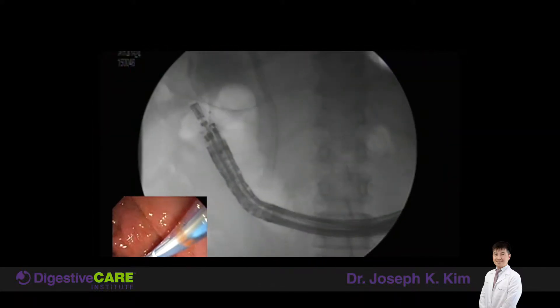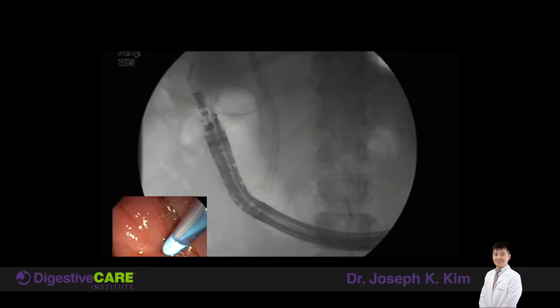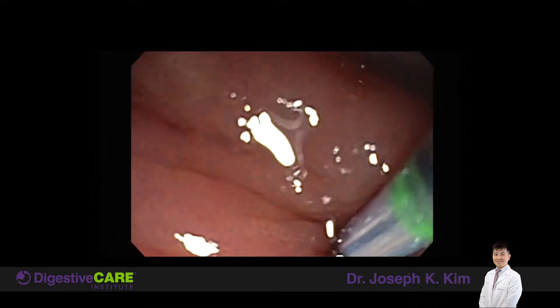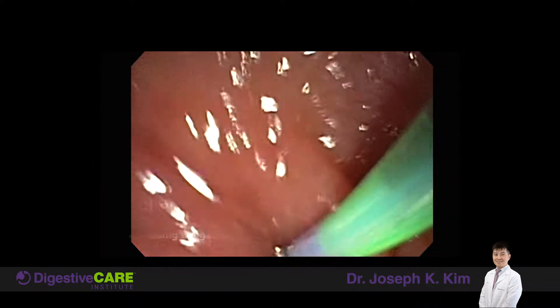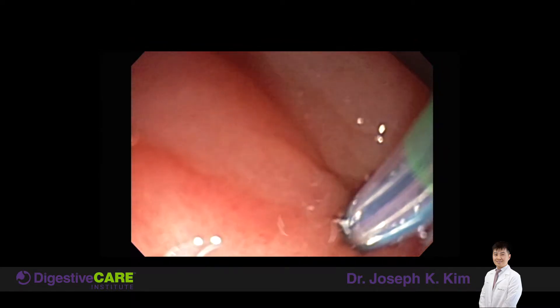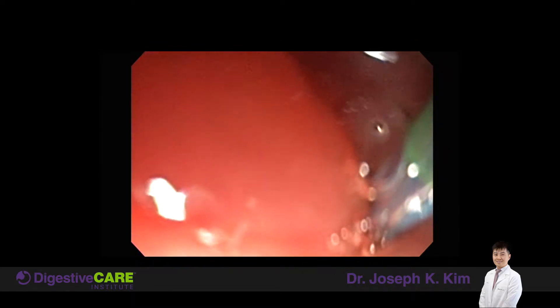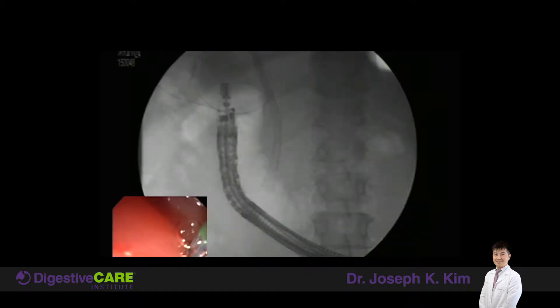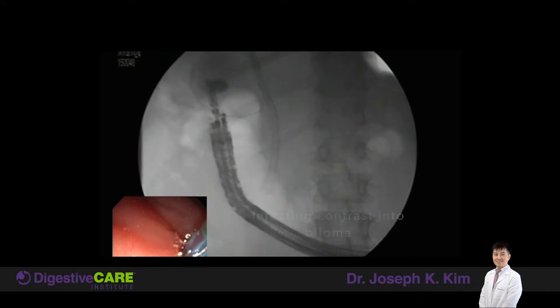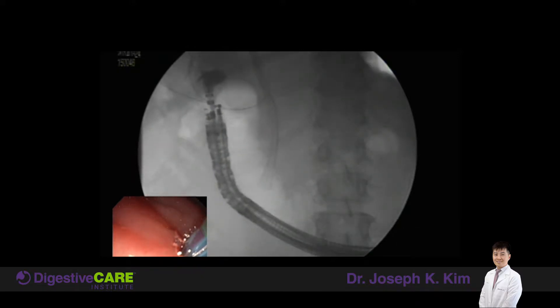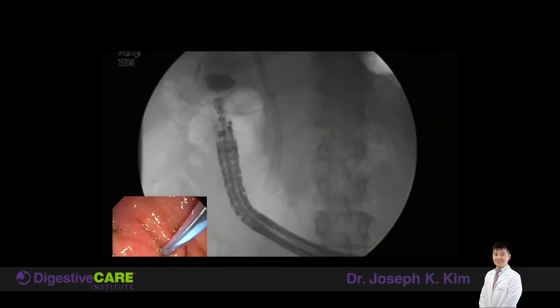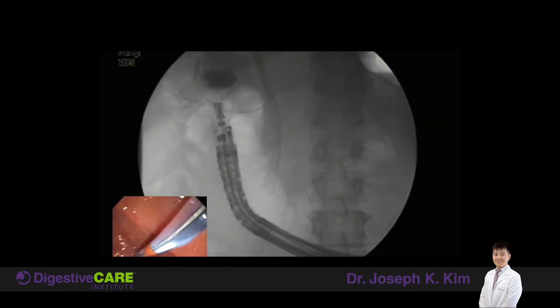This is an x-ray image of the endoscope showing the wire in the stomach and also into the biloma. Now I'm going through it with my catheter, traversing the gastric wall — meaning going through the stomach wall with the catheter — just to access it and make a fistula, which is a connection that we are creating. We are putting contrast into the biloma, and you see that dark black area of contrast filling the biloma space that we are injecting through the catheters, through the endoscope, from the stomach wall.